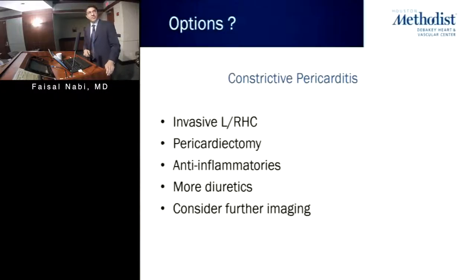And again, I just want you to think about what you would do next as a clinician for this patient. Would your next step be a pericardiectomy? Or would you perform a confirmatory hemodynamic assessment, because after all, this is a very big surgery? Or would you just treat these patients with medicines? Or would you consider further imaging? My job is to convince you why further imaging may be a benefit to you.